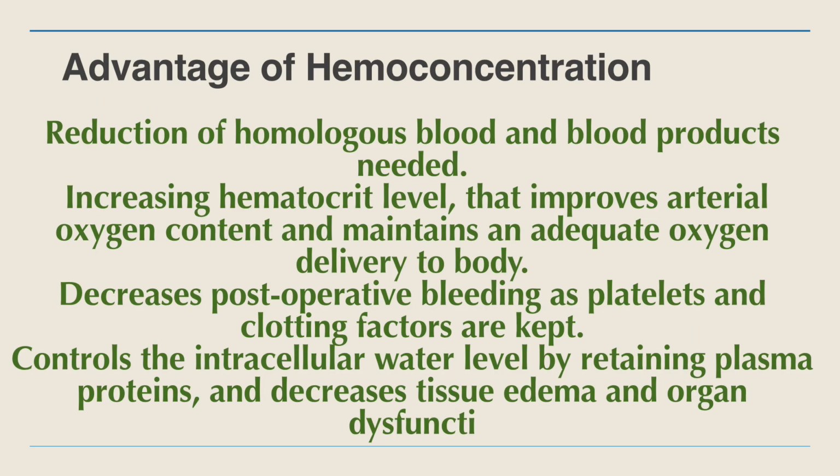Advantages of hemoconcentration: reduction of homologous blood and blood products needed, increasing hematocrit level that improves arterial oxygen content and maintains adequate oxygen delivery to the body, decreased post-operative bleeding as platelets and clotting factors are kept, control of the intracellular water level by retaining plasma proteins, and decreased tissue edema and organ dysfunction.